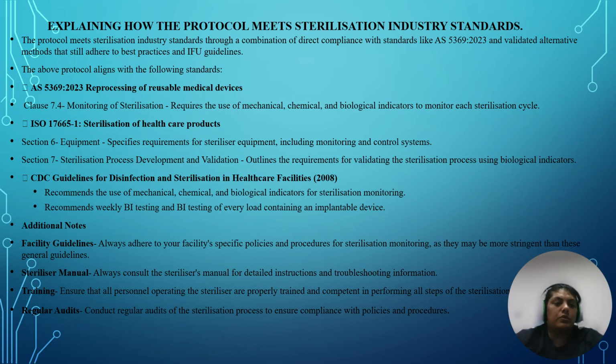medical devices, clause 7.4, monitoring of sterilization services, and ISO 17665-1, sterilization of health care products. Section 6, equipment-specific requirements for sterilizer equipment including monitoring and control system. Section 7, sterilization process development and validation, outlines the requirements for validating the sterilization process using biological indicators.